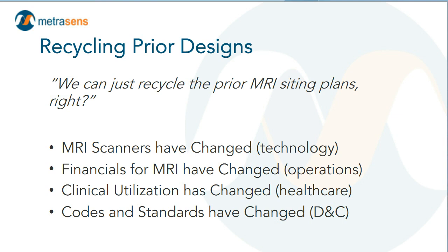Clinically, the patients that we see in MRI today are so profoundly different than patients we saw in MRI 20 years ago. Yes, we still see the walkies, talkies, knees, and heads that were predominant 20 years ago. Those still make up a good proportion of our MRI studies today. But we also have the pacemaker patient and the ED patient and the image-guided breast biopsy, and you get the idea. Plus, our codes and standards about building new facilities have changed pretty dramatically.